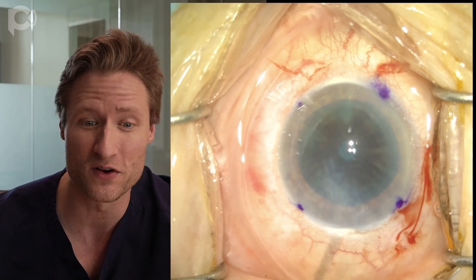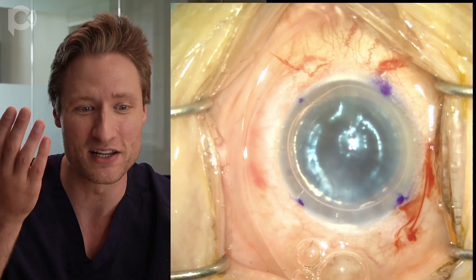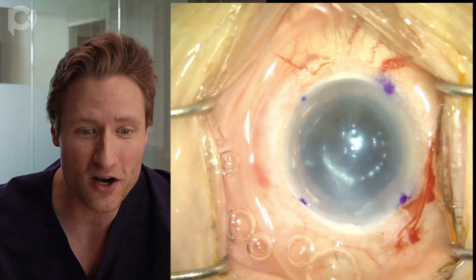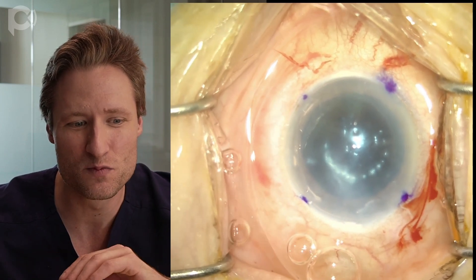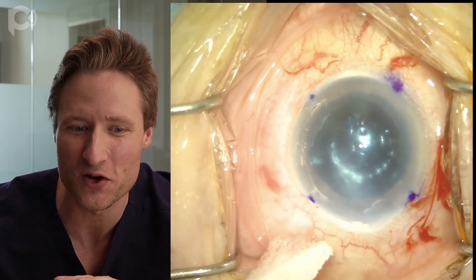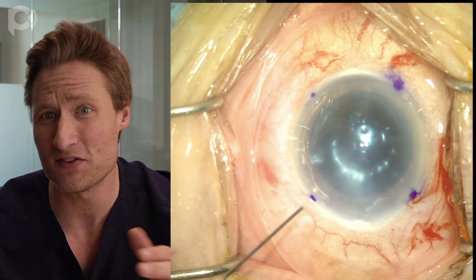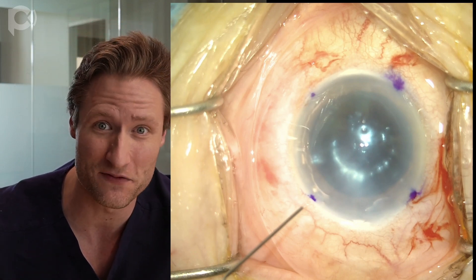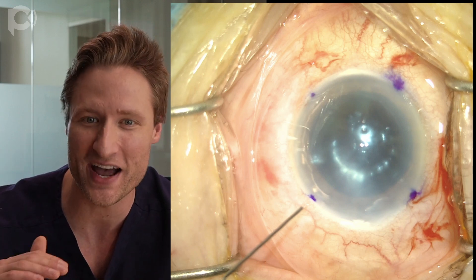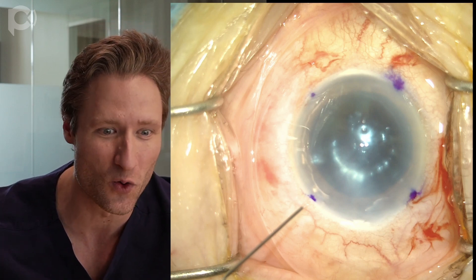Once the graft is unfolded on top of the iris, put an air bubble into the eye underneath the graft, lifting it up to the posterior corneal surface, then pressurize the anterior chamber with more air. That's the end of the case. You'll notice there's just barely a little fluid meniscus visible around the edges of the cornea near the limbus, which means the graft is well supported even when the patient is not lying flat — even when standing up, the air bubble occupies all of the space on the back of the cornea, so patients don't need to lie supine in recovery or at home.